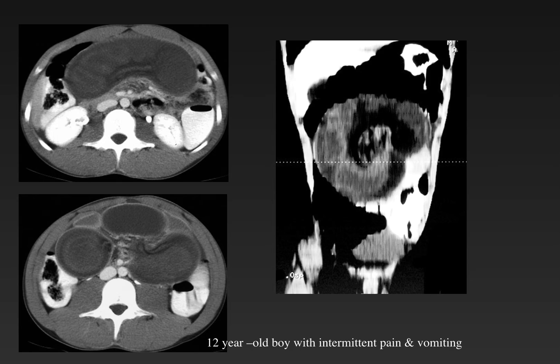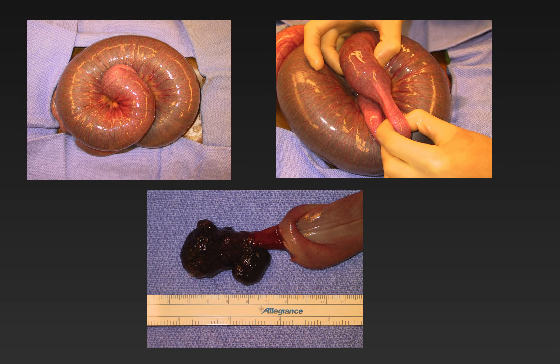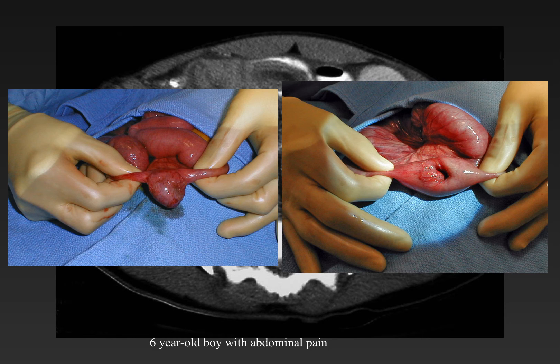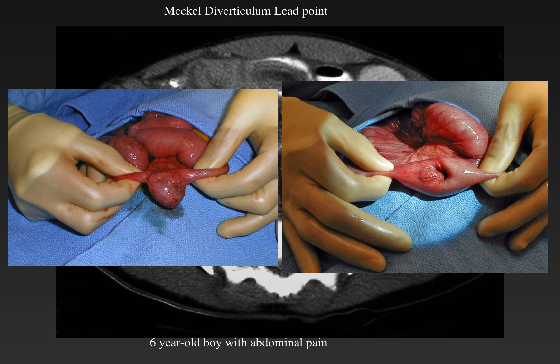The second child is a 12-year-old boy with intermittent abdominal pain and vomiting, and has a large intraluminal filling defect obstructing the proximal bowel. At surgery, a small bowel-small bowel intussusception with a large lead point was found to be a juvenile polyp. The third child is a 6-year-old boy with abdominal pain showing an intussusception in the lower abdomen. At surgery, an inverted Meckel's diverticulum filled with mesenteric fat was found as the cause of obstruction. Meckel's diverticula are a cause of obstruction more common in younger children but can occur at any age.